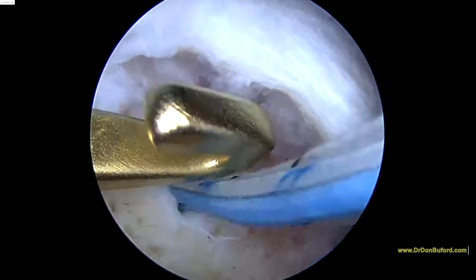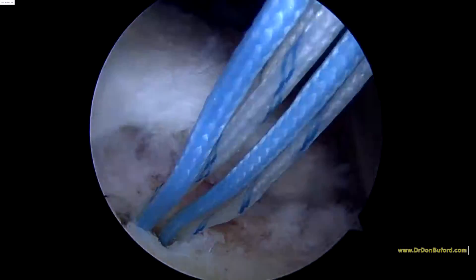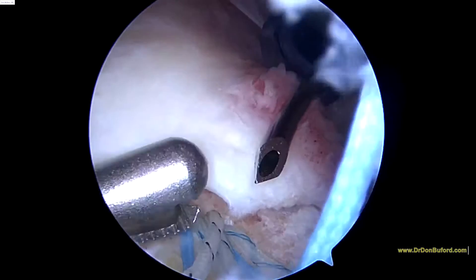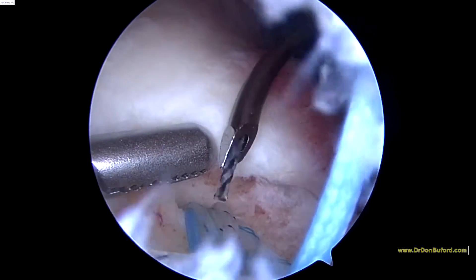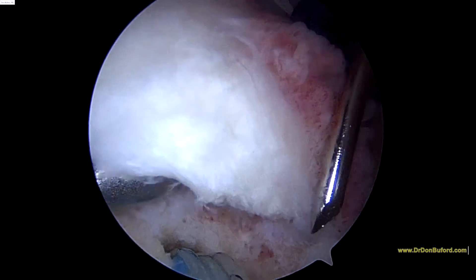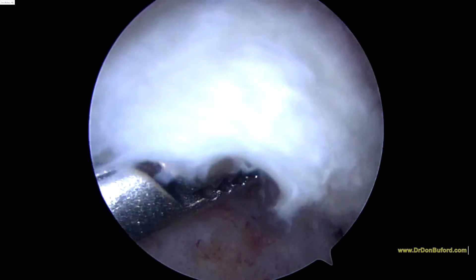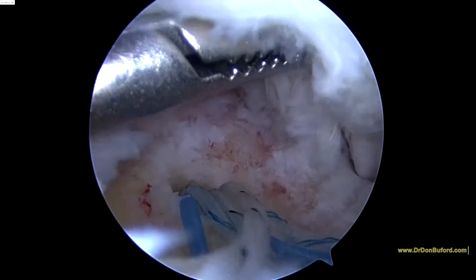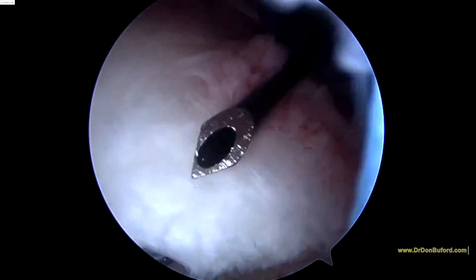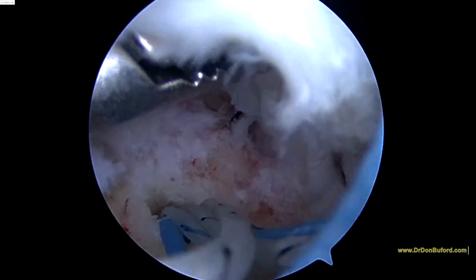I'm going to reach in here and take out which suture we want — I'm going to go ahead and take this black and white striping first with a straight suture hook. We've got a suture hook loaded with a black wire called the Super Shuttle. We're going to reduce this, and I'd like to reach underneath if I can. Now we've got the deep layer — I'm going to pull it back here. We're going to sneak and press. I just want to make sure we've got all the way underneath like that. So that looks good.